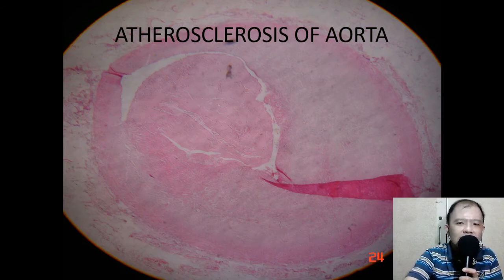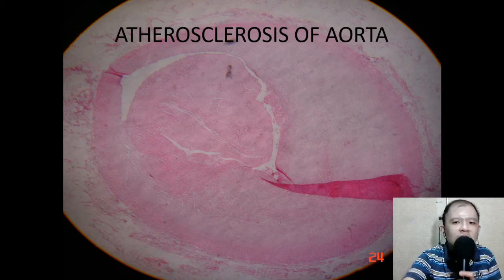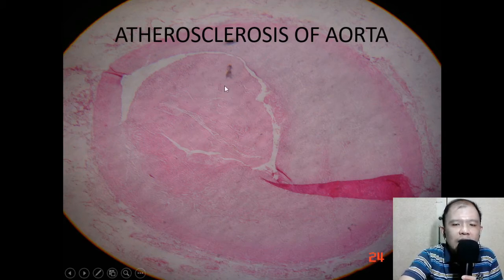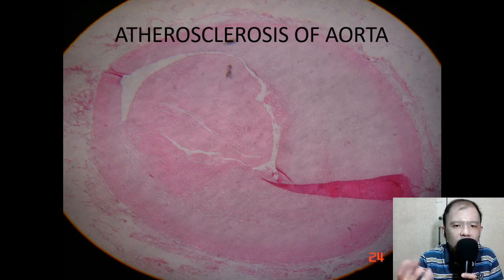Okay. Ideally, we will be able to appreciate the atheroma, an intact atheroma, an intact blood vessel. Okay, this is the atheroma here, and this is the thrombus occluding. In reality, when you look at it in the microscope, the thrombus looks redder, okay?